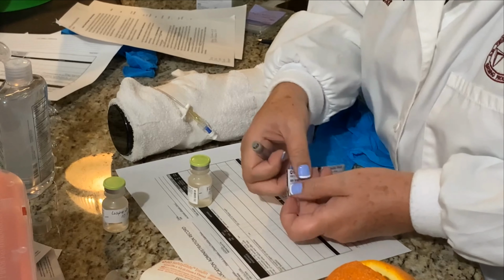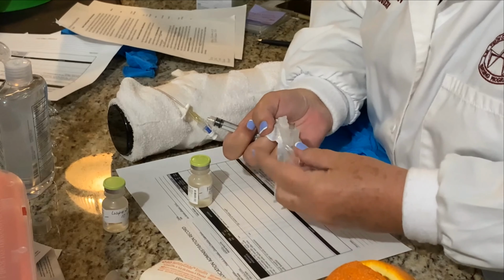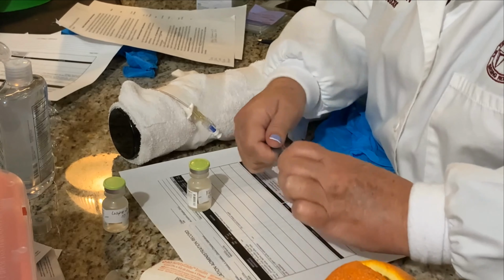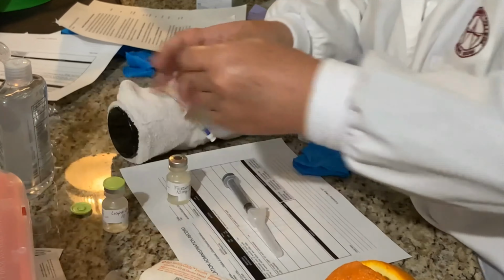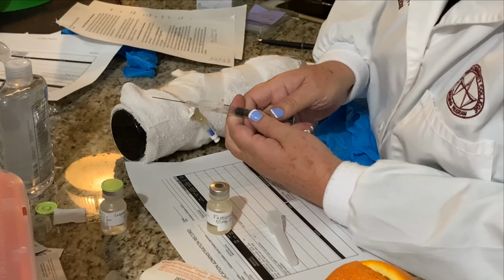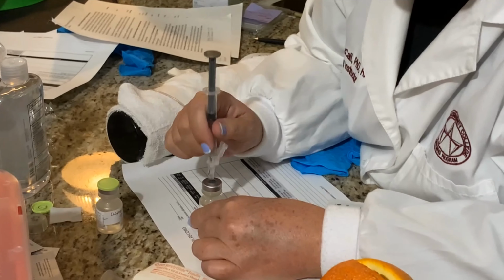Just be careful. Do not contaminate the tip of this because it's sterile. You don't want to use a dirty needle, right? And then I'm going to connect this with no contamination. And again, once it's covered, it's okay to sit it down. So now, I'm going to pop the top off my bottle, get my alcohol swab, and I'm going to scrub it 5 to 10 seconds. Pull this straight out, and I'm going to put in 2 mLs of air because that's what I'm drawing up. Put this in the syringe, in the bottle.